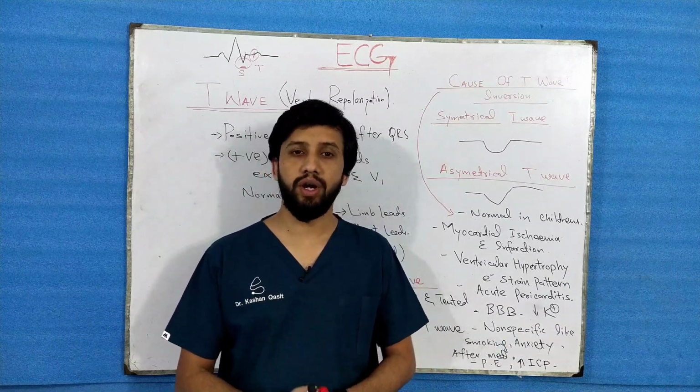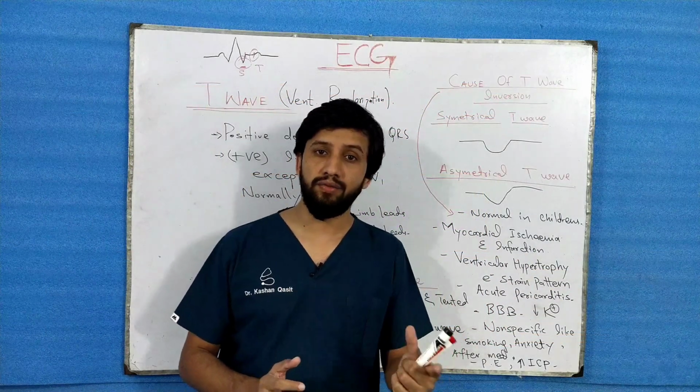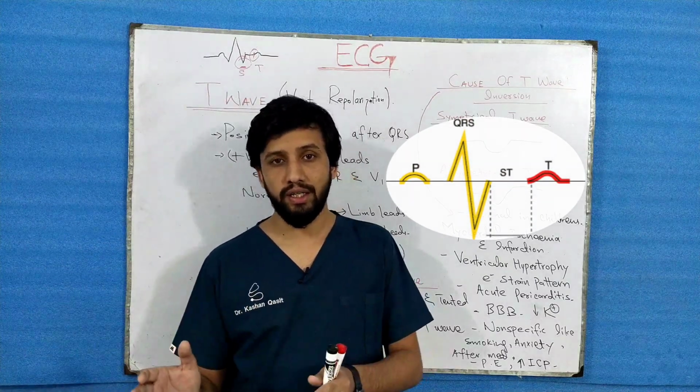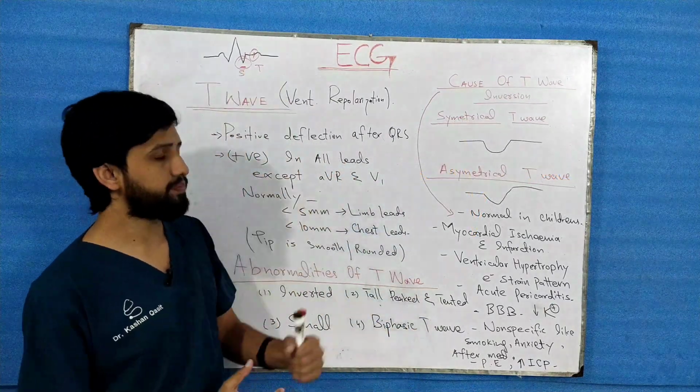Today we were discussing the ECG. In the previous lecture we discussed the ST segment depression. Today we are going to discuss another wave of the ECG complex, which is the T wave, which comes just after the segment we discussed earlier, the ST segment of the ECG.